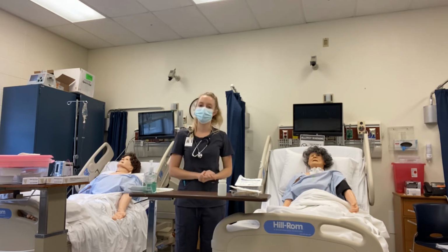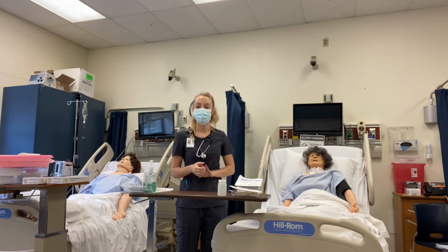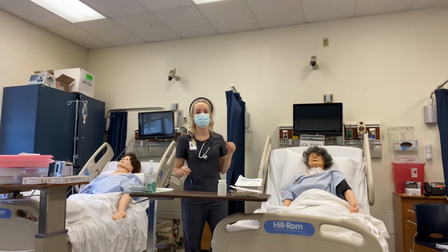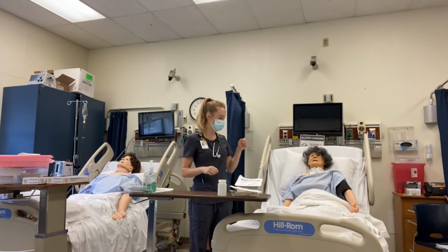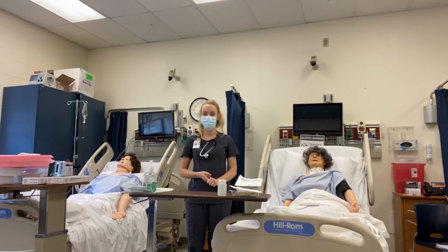Now that I have verified my patient, explained to her the procedure, and taken her vital signs, I'm going to establish a means of communication Mrs. Jones can have with me if she starts experiencing pain or distress. So Mrs. Jones, I want you to raise your hand if you're experiencing a lot of pain or distress during this procedure, okay? She says okay.